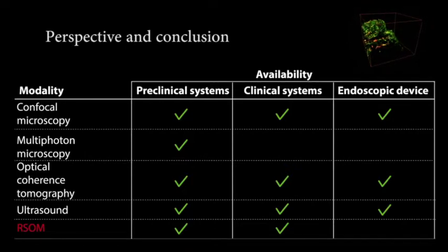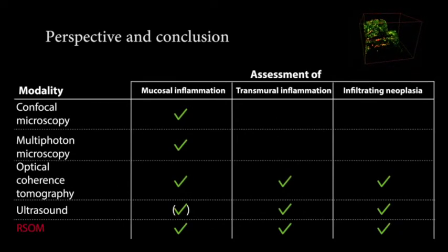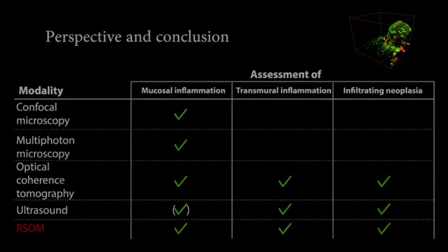In comparison to others, RSOM might be helpful to solve different questions concerning whole intestinal wall assessments better than other existing or future technologies. Through an EU-funded project, EsoTrack, RSOM is converted into an endoscopic device and therefore it could be a valuable instrument to visualize whole wall inflammation in inflammatory bowel disease or the depth of suspect lesions in tumor diagnostics.